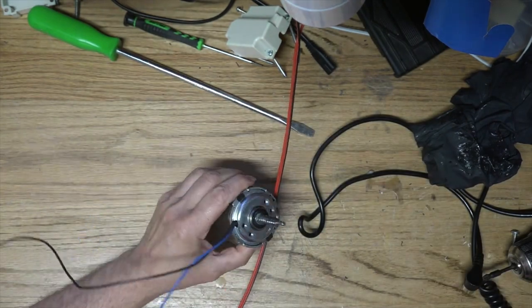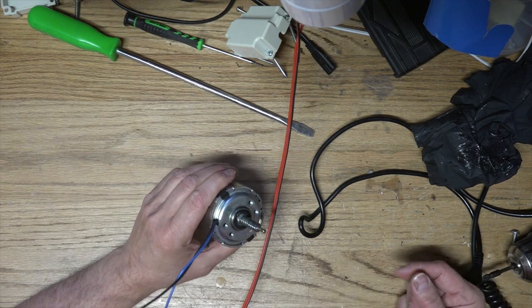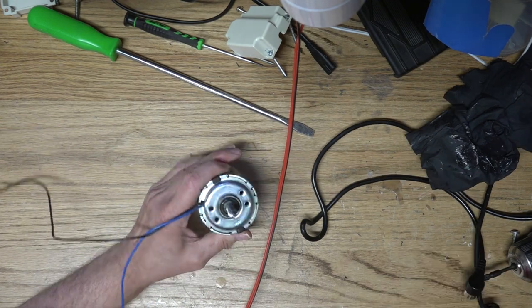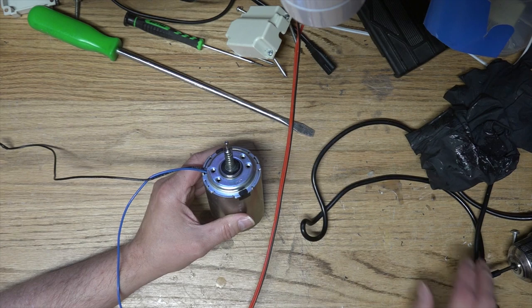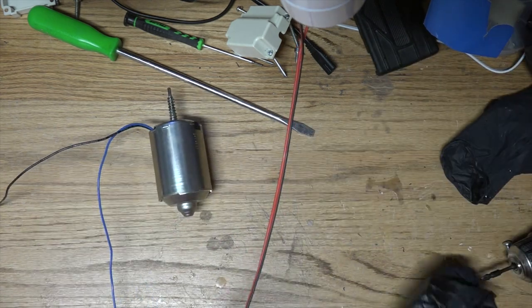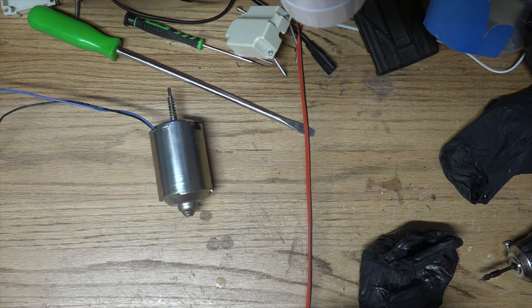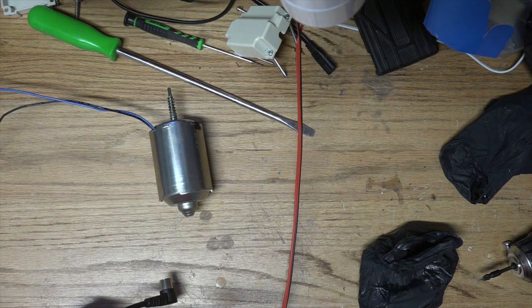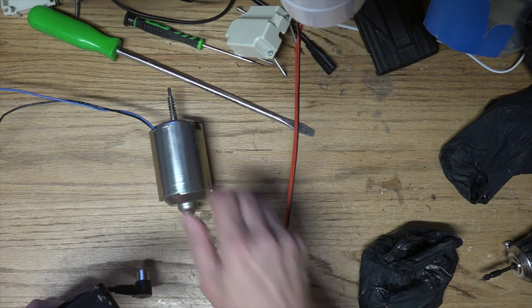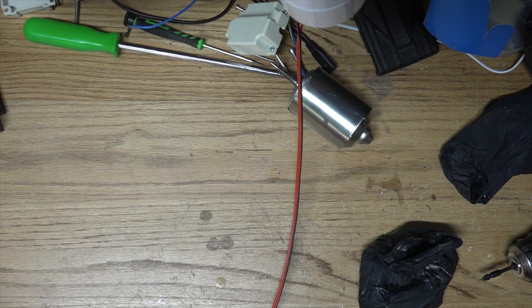And then with the gear reduction, the worm gear and the other cog in there, and the lead screw, that's a lot of torque. So yeah, I think I might bag those pieces with grease on and take the motors out and save the remote control here. You know, this would be handy for maybe moving a camera back and forth someplace on a lead screw. So, all right. Well, I'll pop up whatever information I can find on this motor, and I think I'll take the rest of it apart off camera.